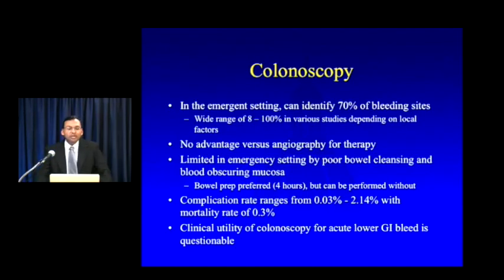Now, traditionally, people have said that it's colonoscopy, and that's certainly what I was taught as a resident. I was taught that there's really no indication for CT in patients with lower GI bleeding, and that everyone should go straight to colonoscopy. I was taught that it was sensitive, that it was specific, that it was safe, and that it would facilitate treatment. And all of that is relatively true to a point. The problem is that it's great in the outpatient setting, right? If you have a patient who comes into the outpatient center, it is very sensitive, very specific, the patient has had a bowel prep, no problem. It's a safe study and you can facilitate treatment.